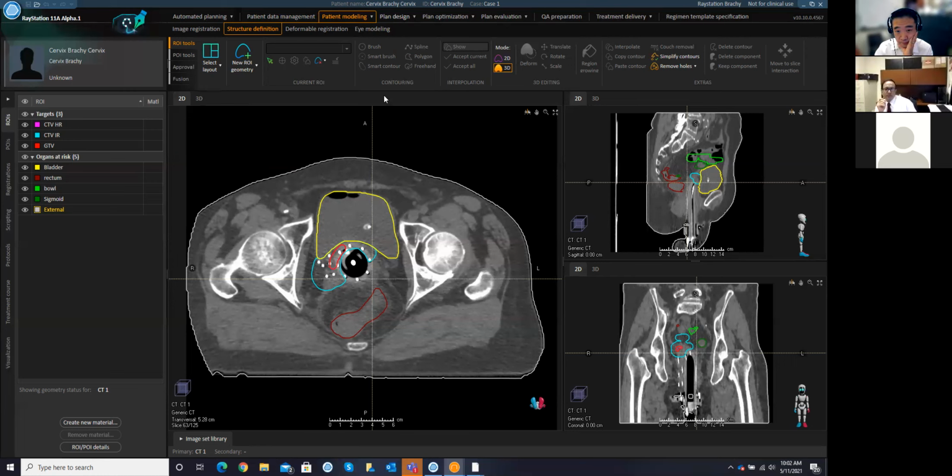Quick question. Yes, sir. Can I use RayStation for seed implant? LDR seed implant? Not yet. Currently it is just HDR. Okay. But if you look at our track record, we'll probably be on the road to be able to do anything that people would like. We really make changes quite quickly.